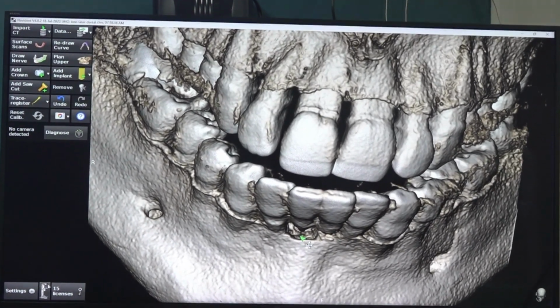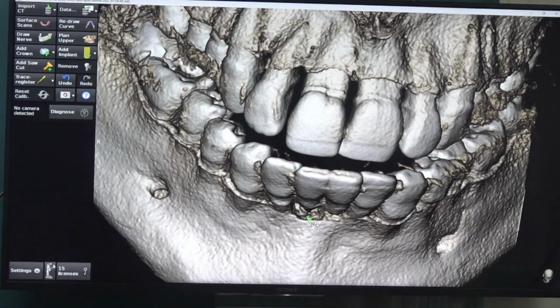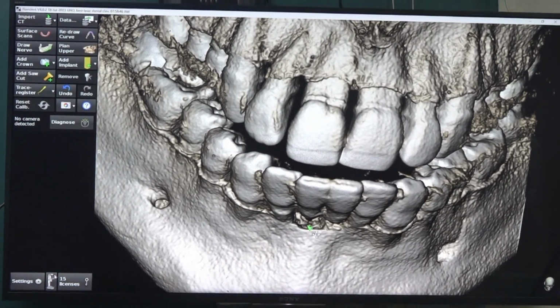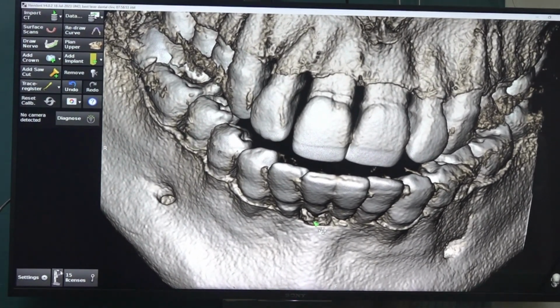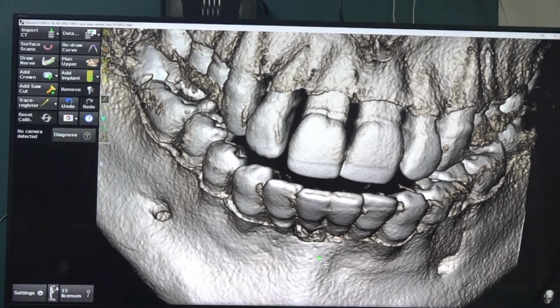So 4 incisors, 2 implants is a tricky situation. You have to achieve good stability for both implants. If canine to canine goes for extraction, you can plan for 3 or 4 implants. But most commonly 4 incisors is the situation we see in practice.